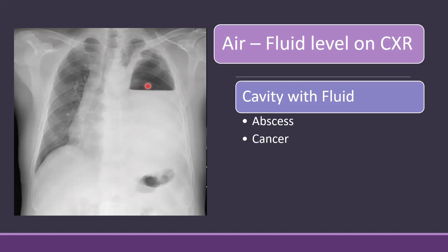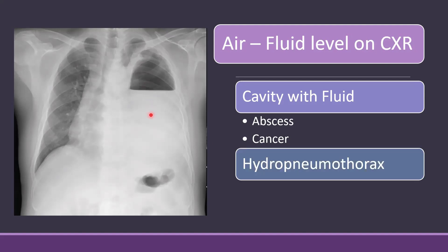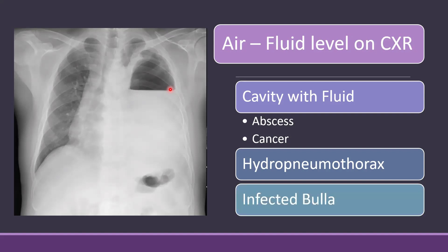The second cause of an air fluid level is a hydropneumothorax. As you know from previous videos, an effusion does not give a straight level — in effusion there is a concavity, or a meniscus sign is present. So when a straight level is present, you should not call it a pleural effusion; you should call it a hydropneumothorax.